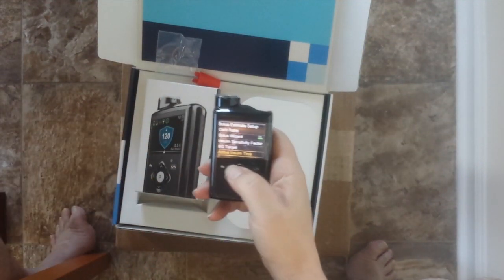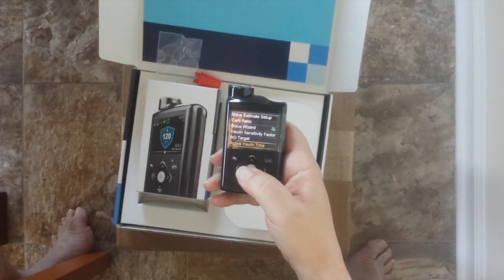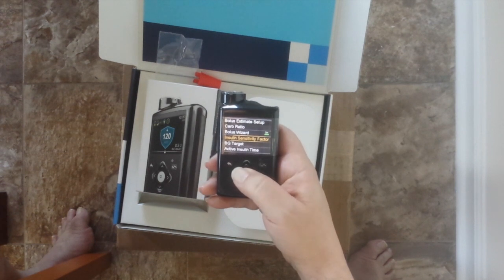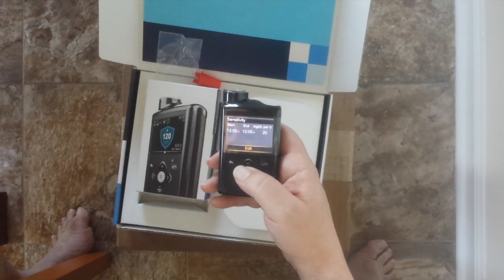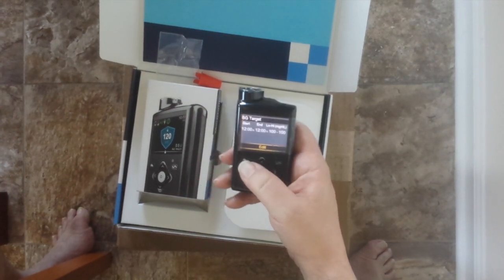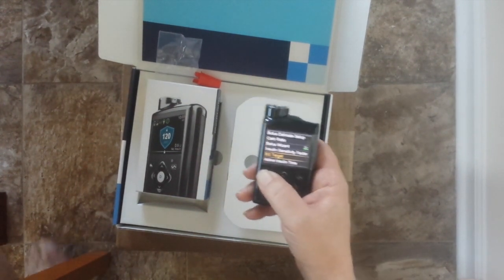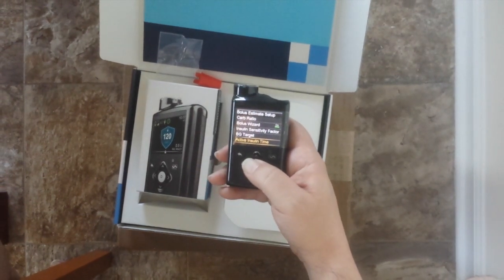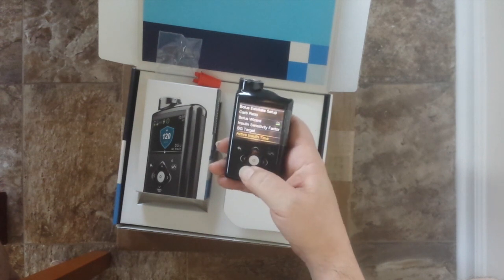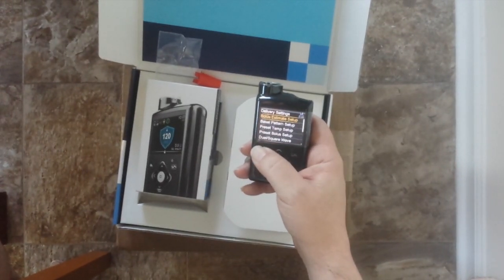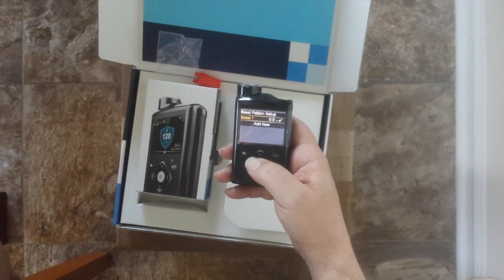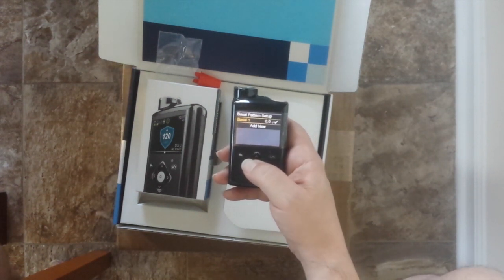After setting up my bolus wizard, it sets up menu options that make it easy to change the insulin sensitivity or go to the blood glucose target. When I talk to my doctor in a couple weeks, we can discuss the active insulin time. It's very easy to go back in and change — I haven't set it up in months since my old one. Up next will be basal pattern setup.